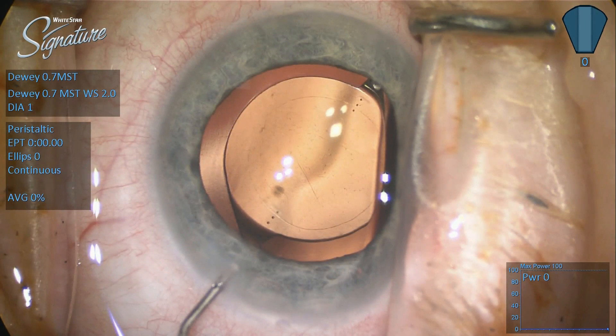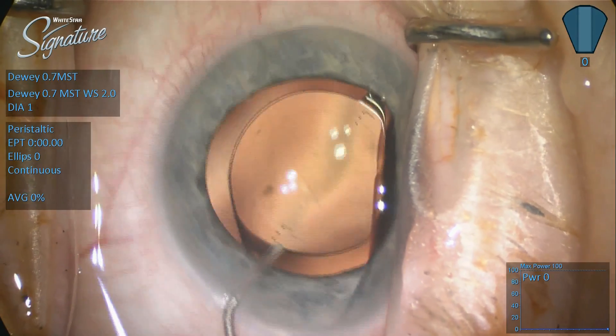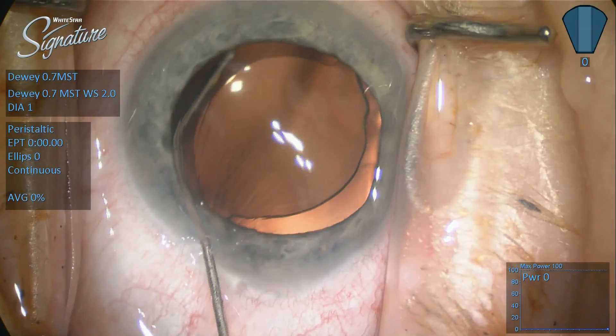The lens had very little adhesion and was easily rotated into position — almost no regenerated material at this point. So we've got really good alignment here, and most of the time I would say we're done if that was a primary rotation. But this is a secondary.